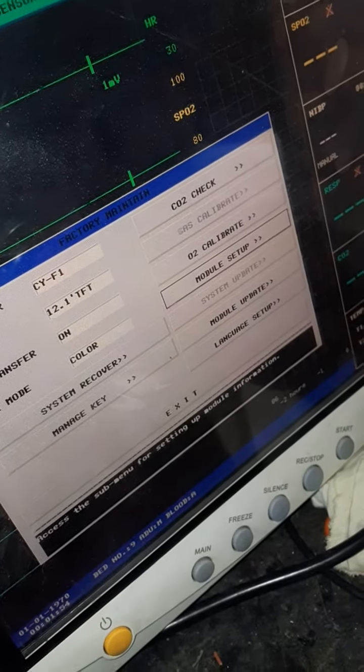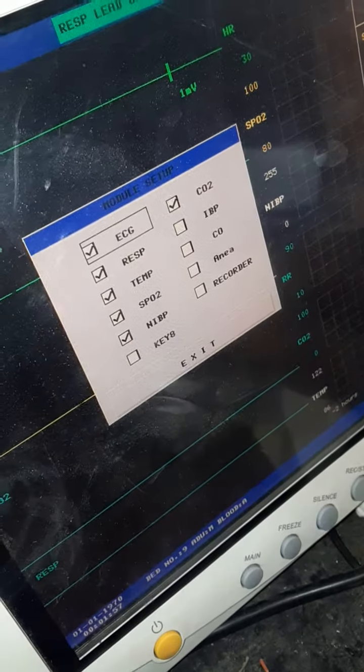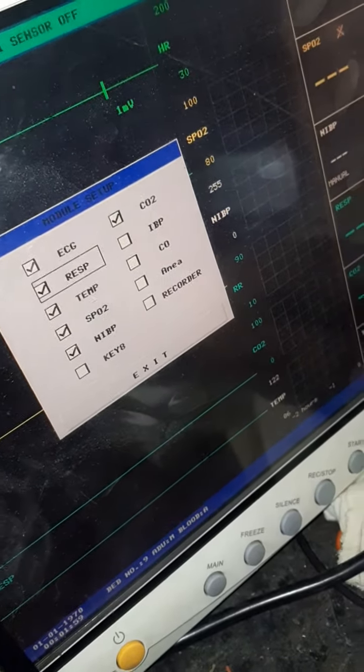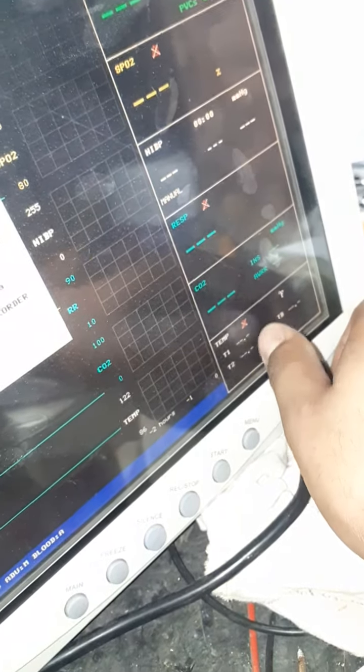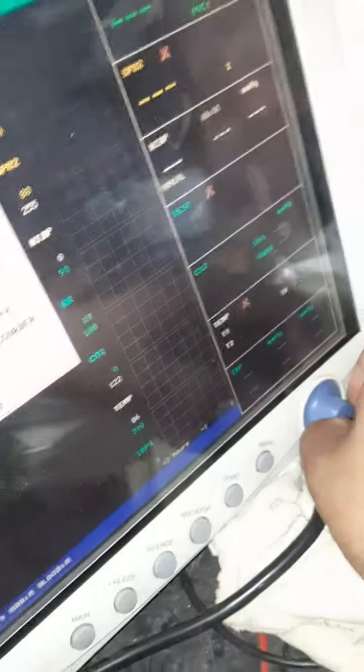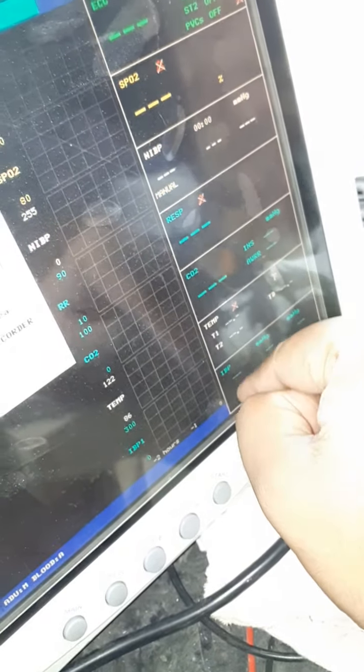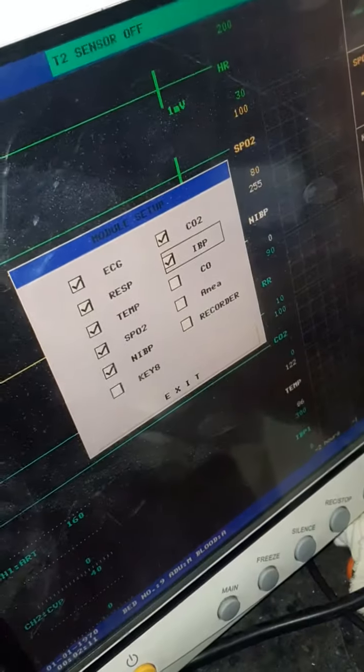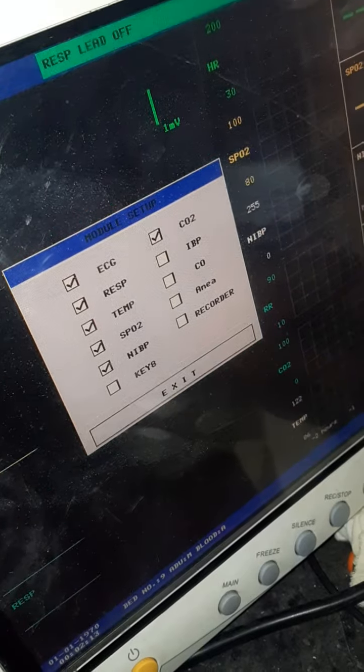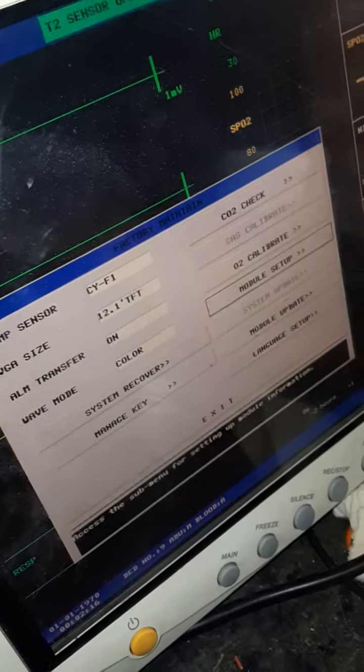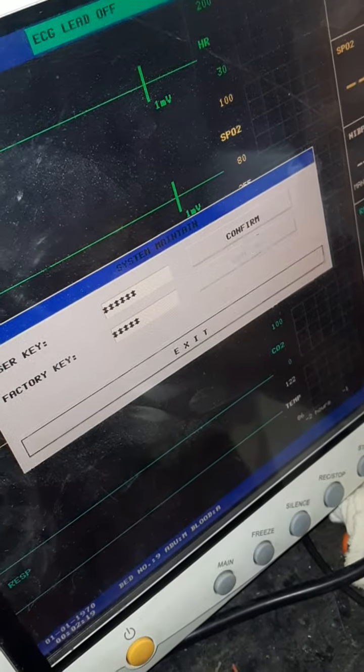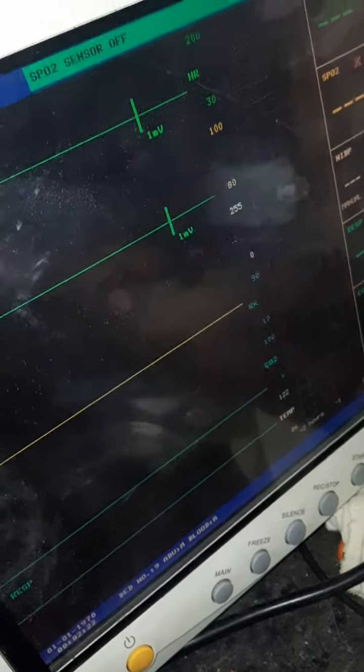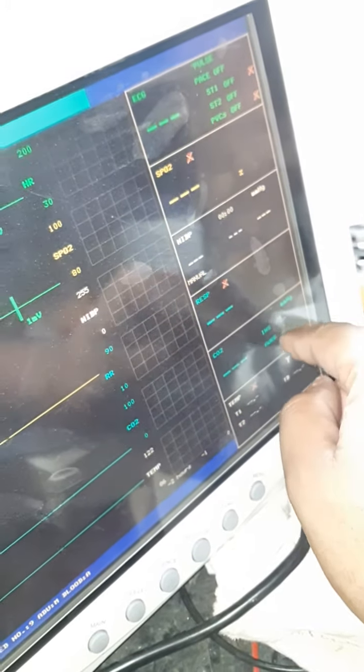You have to go to module setup. Press module setup and you'll see what modules you need. In my monitor, CO2 is there, everything is here, but IBP is not there. If I click IBP, I will get IBP in the last corner. If I want to remove it, I can. You can convert your monitor to three parameters by reducing them. After doing this, go to the exit button - press exit two times and you'll get the same settings on your front display.